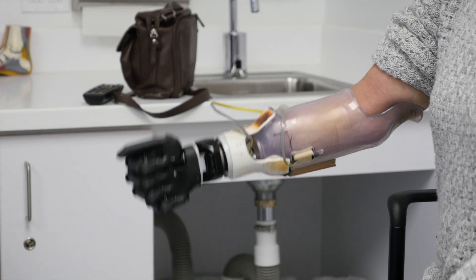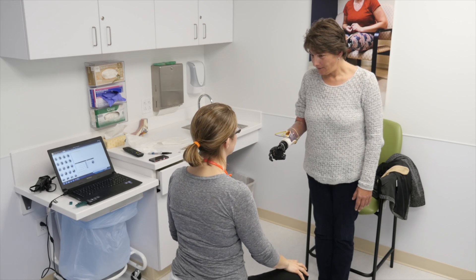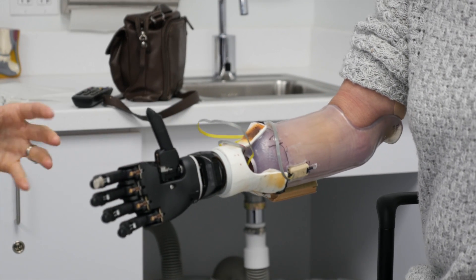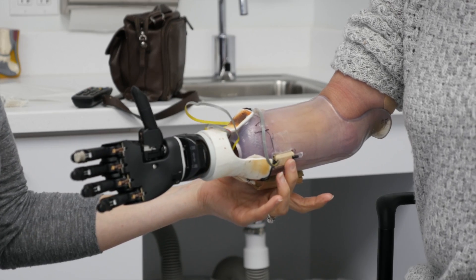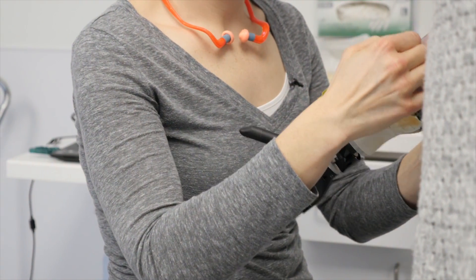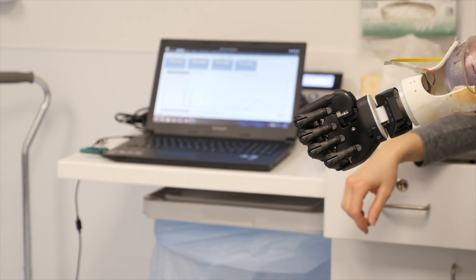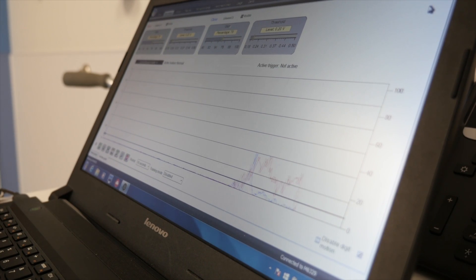That's some weight, huh? So we do the test socket so that we can make these changes. I want the best fit up here, we want the best fit down here. She's probably going to change a little bit with the tightness of the socket. The most important part is where these electrodes are — she's been working with Ashley on finding the best site. But once the socket's on, that changes where the muscles are, and putting the weight on changes where everything is. So we may have to play with where that electrode is.